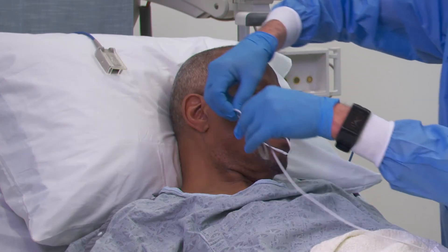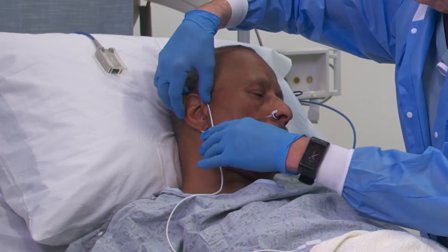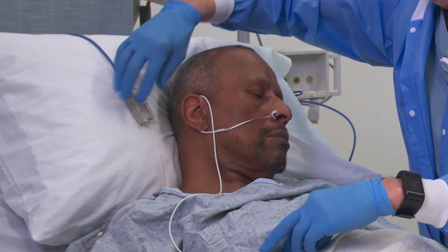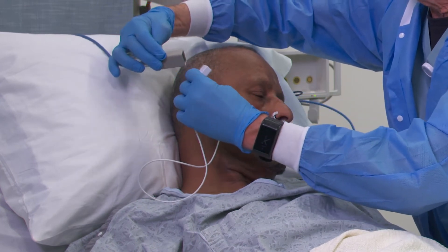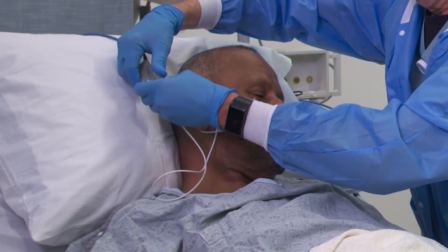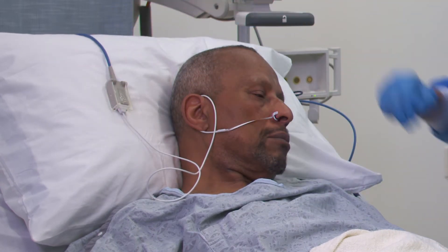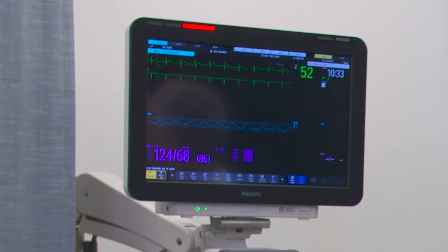Once the sensor is in place, you typically secure the cable around the ear to strain-relief it a little bit. When plugged in, you can see the red LED active, signal acquisition begins on the monitor, and you have a saturation value that is more resistant to hemodynamic instability than a peripheral sensor.